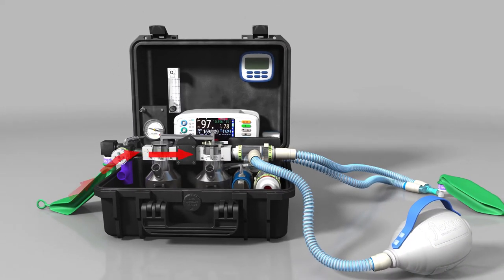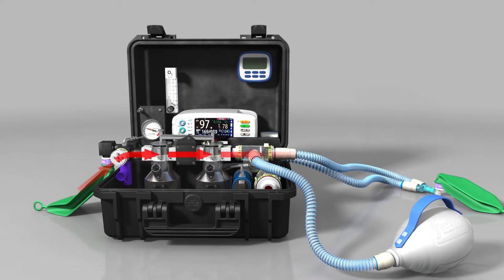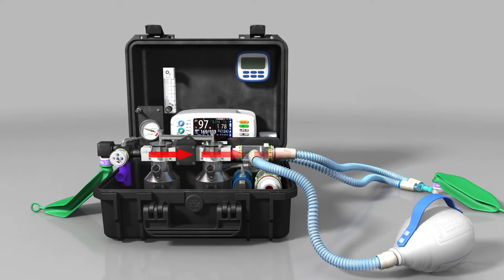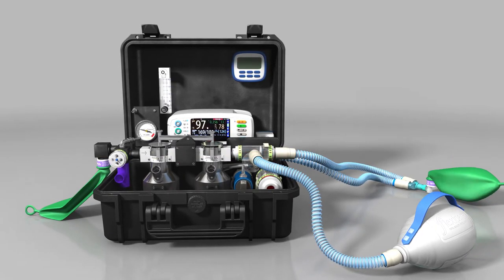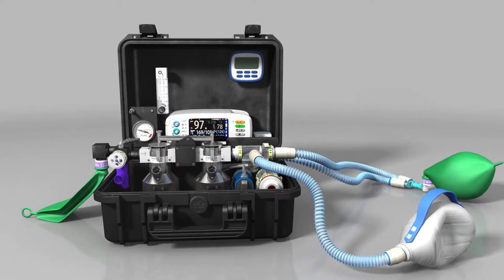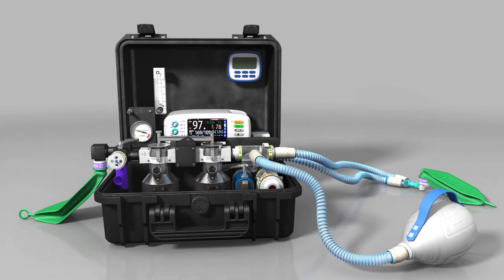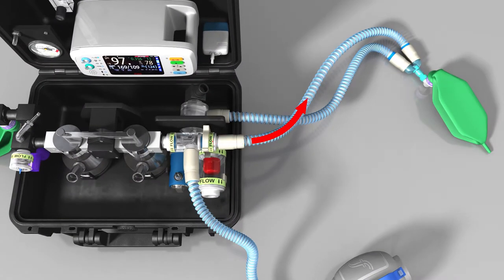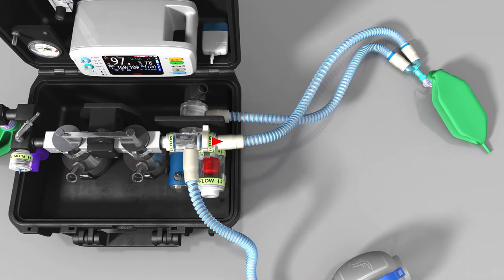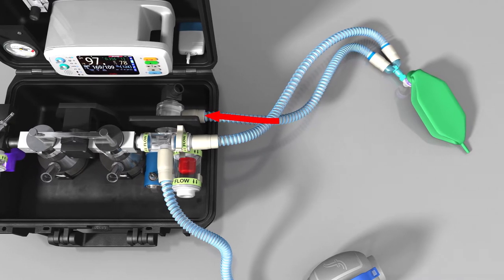The gas flow in the circuit works by entraining air through the one-way valve at the front of the reservoir block. This is either controlled by the patient's own inspiratory effort when spontaneously breathing, or through controlled manual ventilation by the anaesthetist squeezing the self-inflating bag. One side of the tube connects to the inspiratory valve, and the other side connects to the expiratory valve. Gas flows out down one side of the tube and back down the other side.